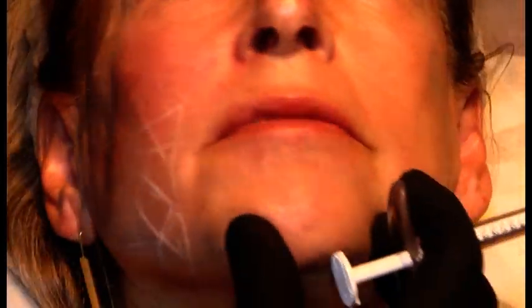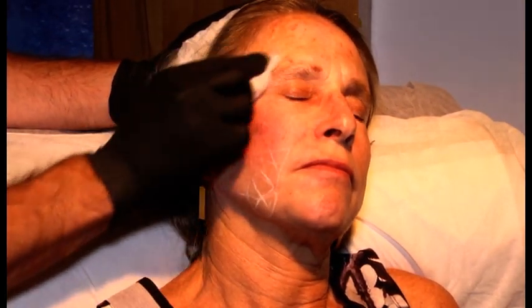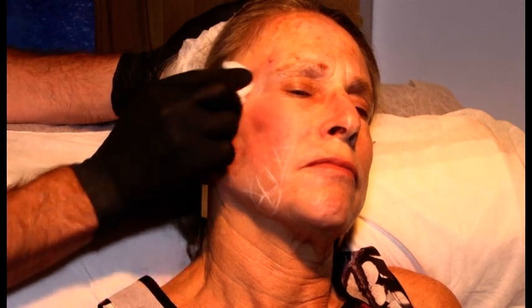How are you feeling? You okay? Mm-hmm. Yeah? All right. So can we switch to Belotero Revive, please? Okay. Let's do both. Let's start with cannula. Actually, let's just do the needle. Let's do the needle that is included in the box.